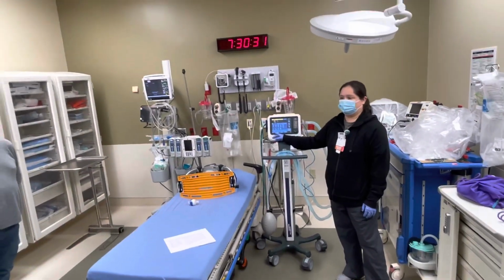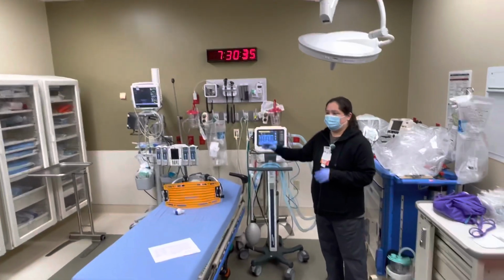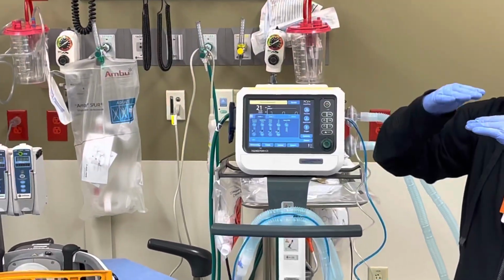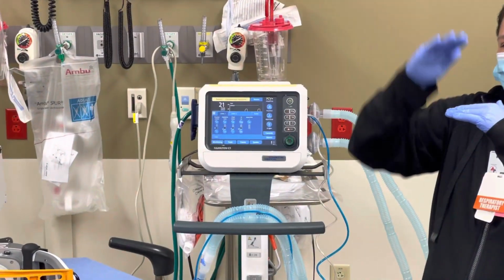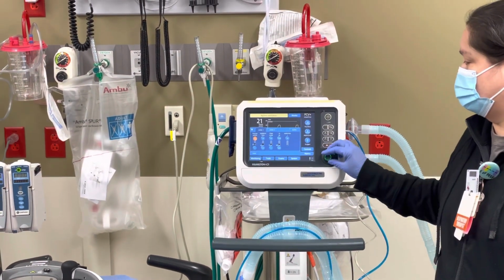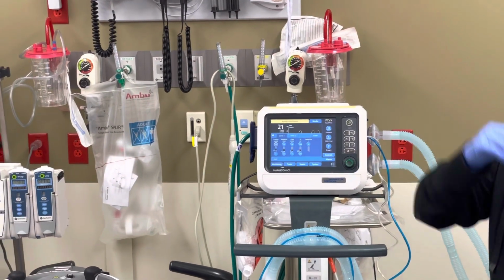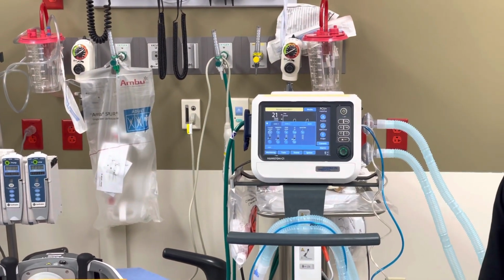So it's going to tell me to change it? Yeah, whenever this lights up yellow and that line's trying to go up, what it's telling you is this pressure's too low, I can't go any higher. So you'll know, oh, this is the one I need to increase, and you'll increase it a little bit. That helps a lot to catch the patient. Thank you for telling me.